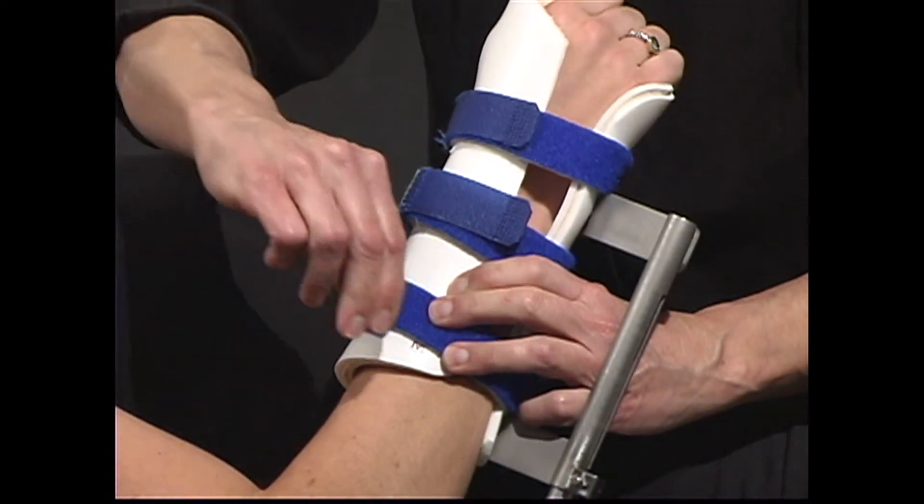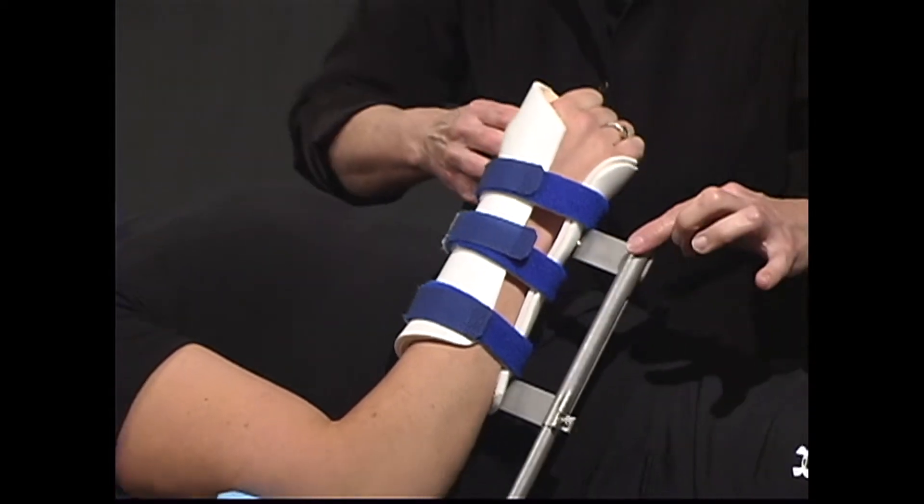Once the patient is in, the preset tension will stretch the patient to the desired position.